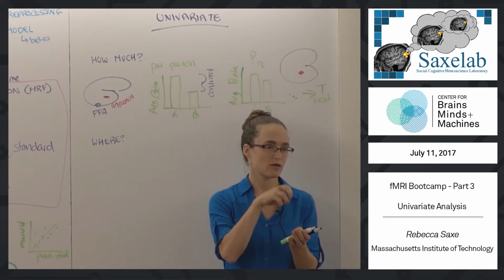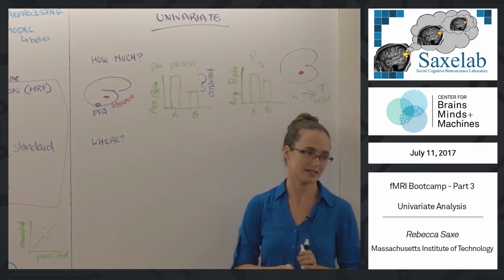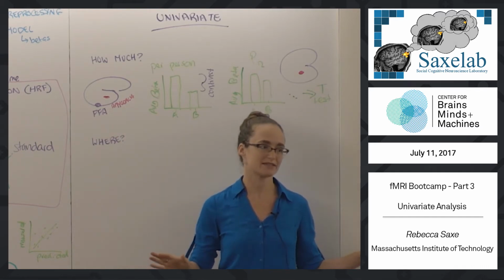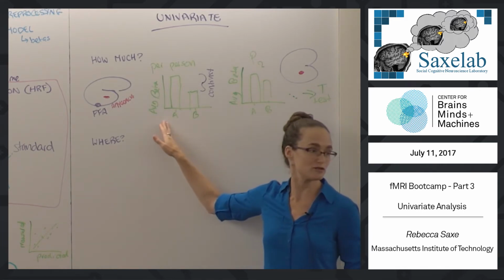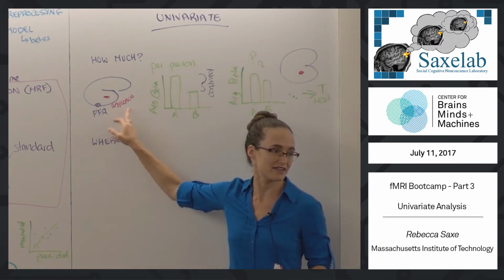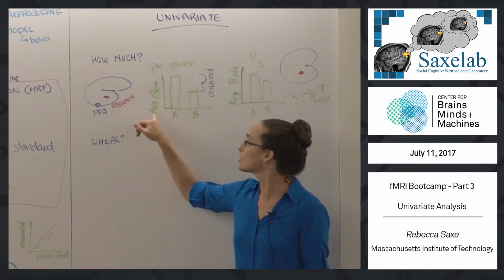For regions, once you fit betas with decently comparable data across subjects, the distribution of the betas doesn't violate any of the assumptions you'd make for a t-test in general. And whether or not averaging these betas is a good way to represent the activity in a region totally depends. That's a complicated question. So the simple answer is yes, if you do this procedure, it's reasonable to do a t-test over the across-subject measures. And we'll come back to what's inside this average many times, because averaging the betas per region is only one of the things you can do with them, and we're going to do a ton of different things.